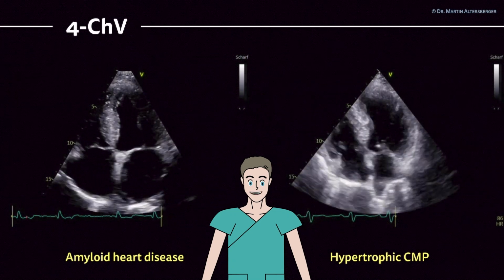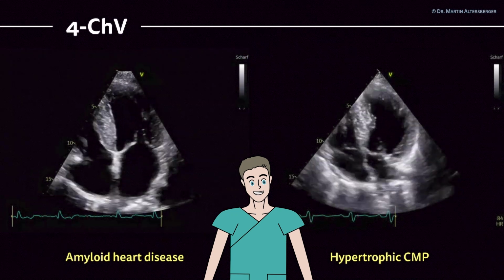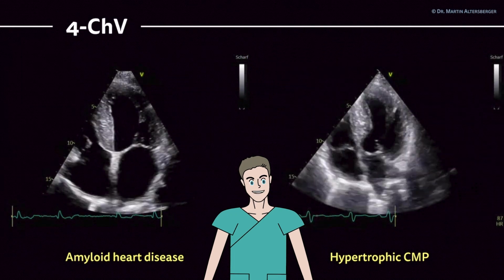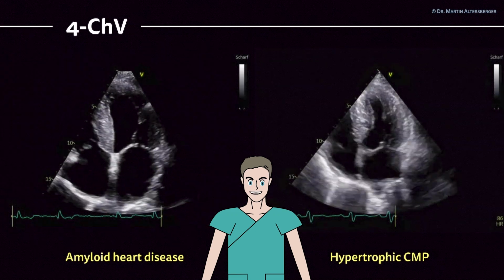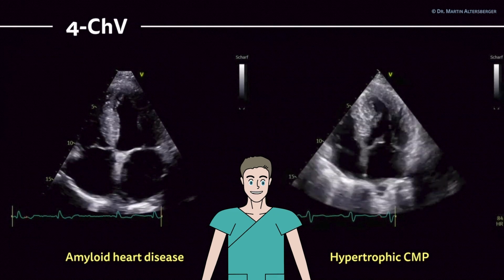Or to be more specific, a left ventricular ejection fraction which is reduced. Of course, left ventricular function is, in this case, probably severely reduced by means of strain imaging. This patient had a global longitudinal strain of around -10%.